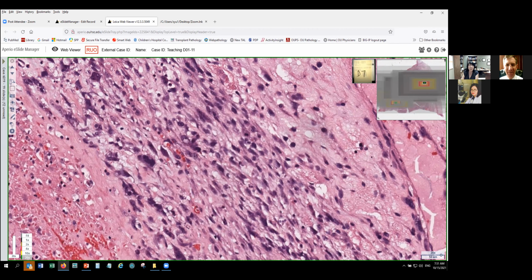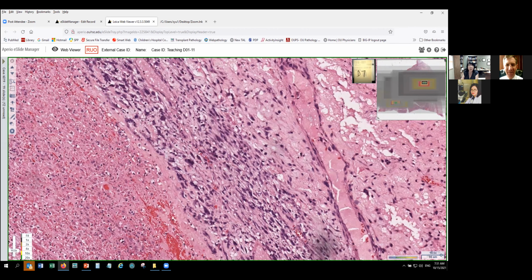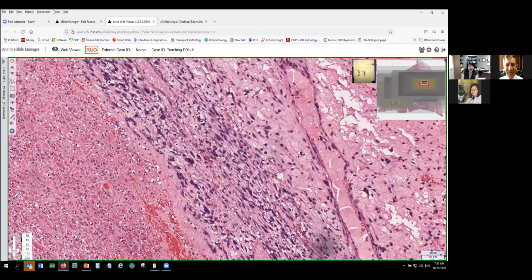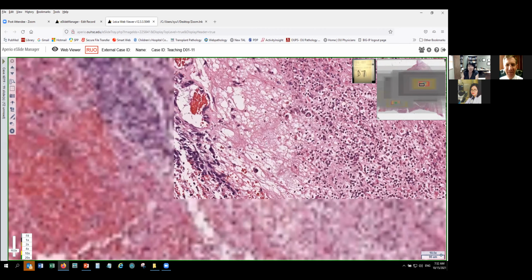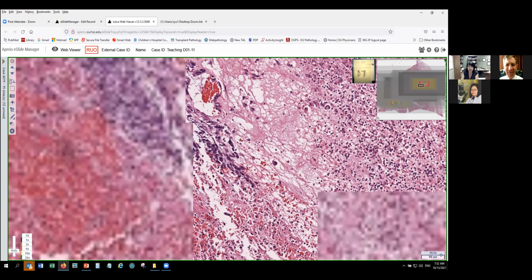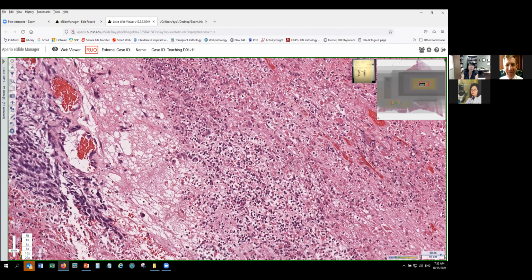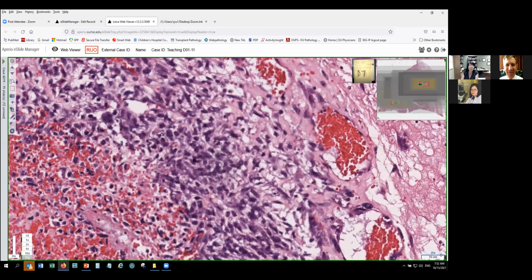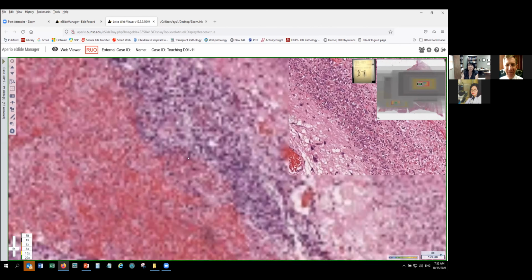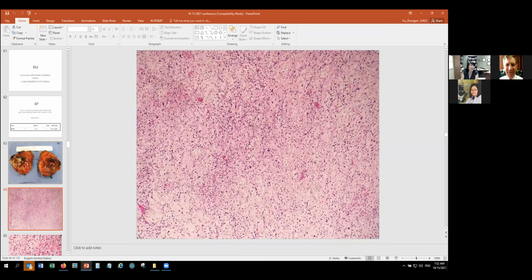See the mitosis. And characteristic for this undifferentiated embryonal sarcoma is spindle cells, very pleomorphic, and it's also a diagnosis of exclusion of other sarcomas. The feature I want to show you is the cytoplasm granules. Slow down. Not sure you can see it, very pleomorphic. I think I can slow down. Okay, let me just show you some pictures, probably easier to see.